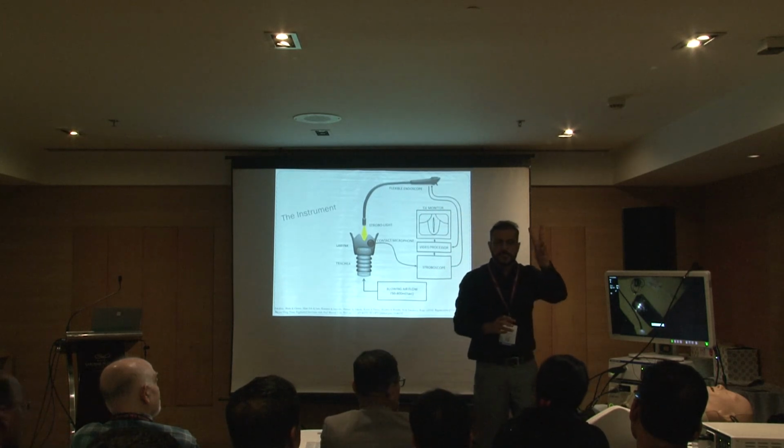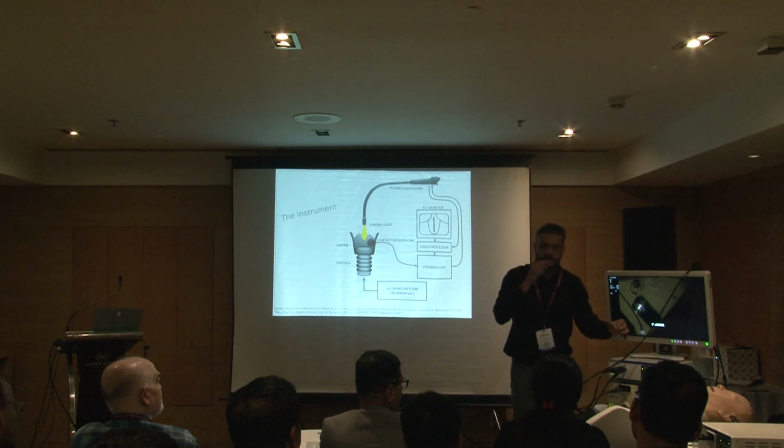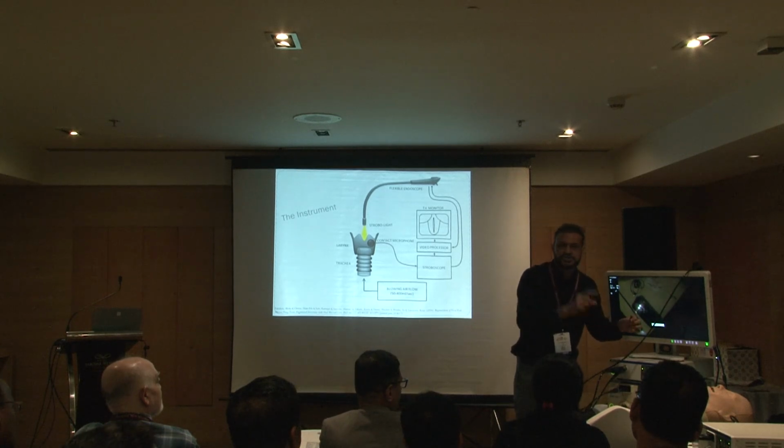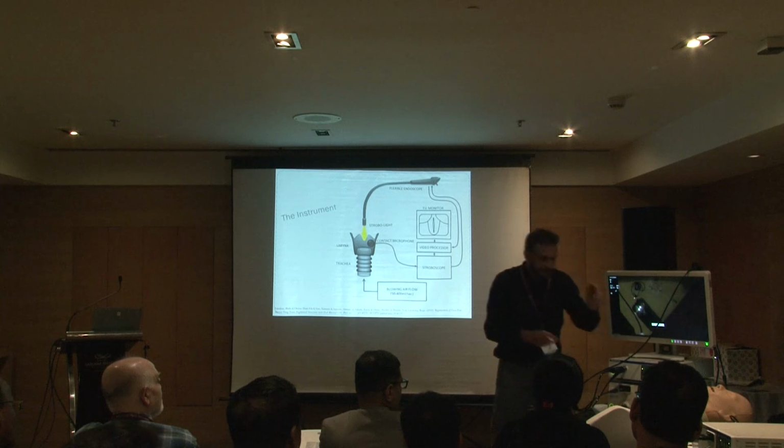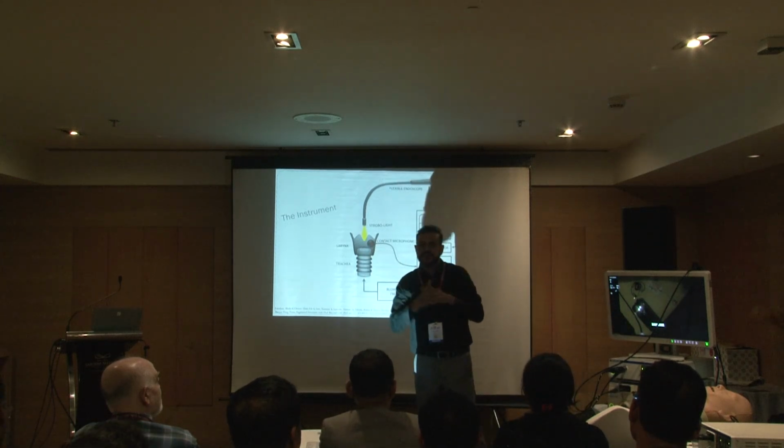Then there are 2 more things. There should always be a mic attached, either the collar mic or the simple mic. Anyone can be used. This is to know the fundamental frequency. Now there are 2 things: whether to get a rigid or a flexible scope. Again, a very, very important question.